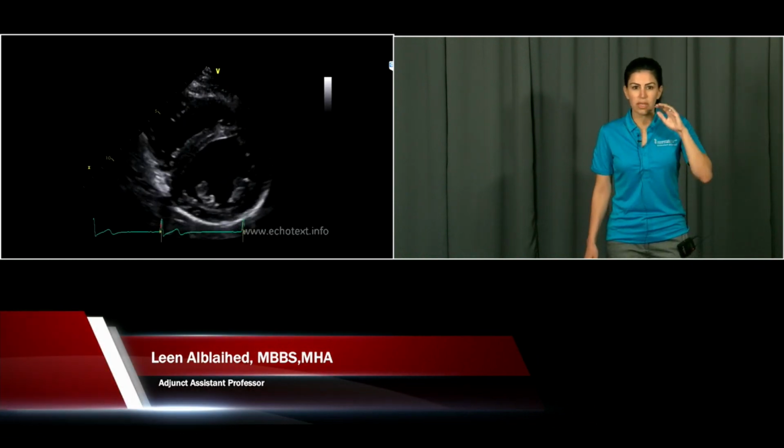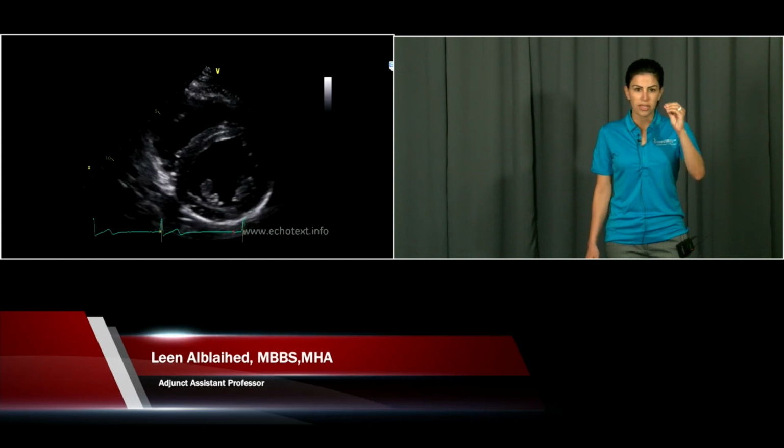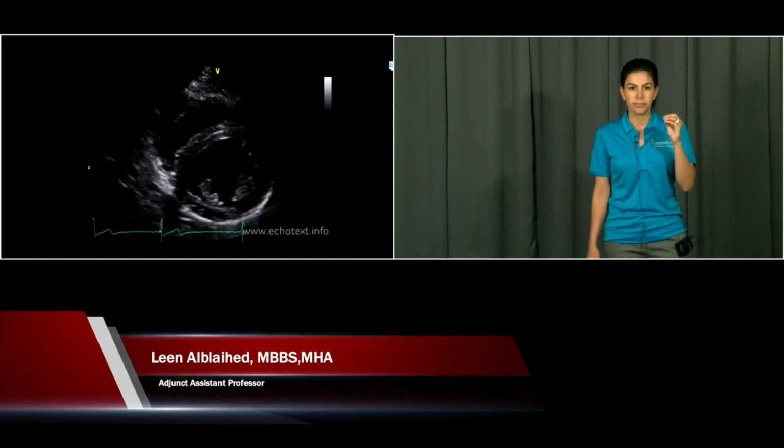Here, you can see the entire myocardium, all aspects of it, getting thicker and thinner and squeezing nicely. This is a normal parasternal short.